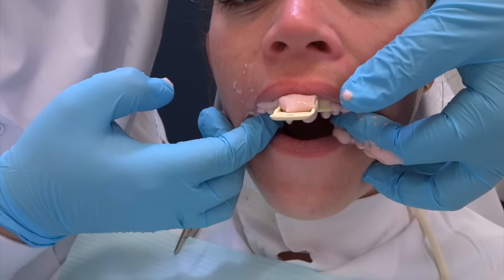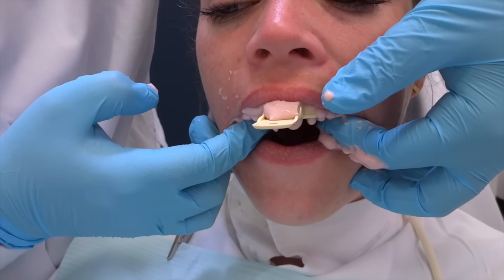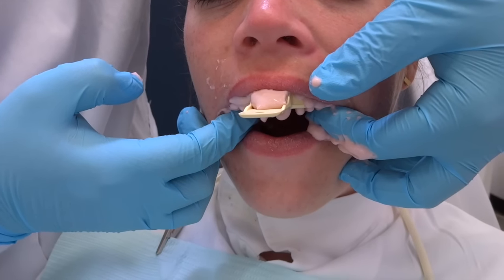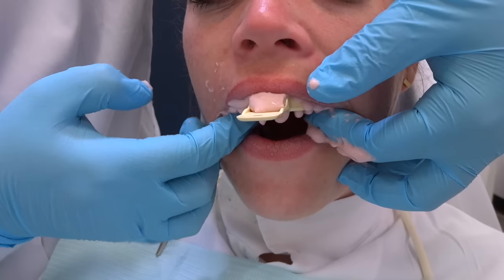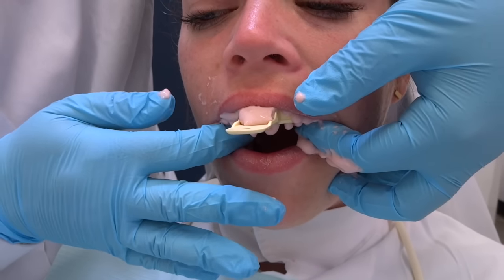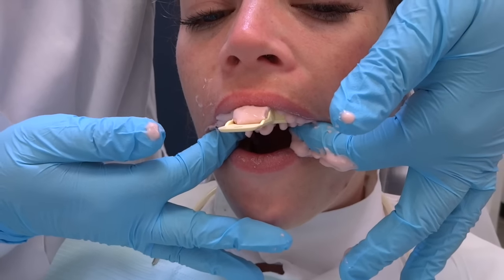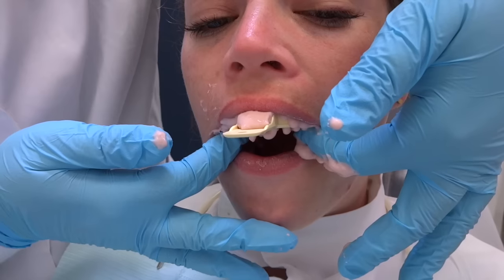When taking an impression, a lot of people just take their hands off and walk away and let it set up on its own. Always keep your hands in. That'll prevent the tongue from pushing the tray, prevent the patient from biting down, and it'll make the patient feel more comfortable and stable. Always keep at least two fingers on the tray as it's setting up.